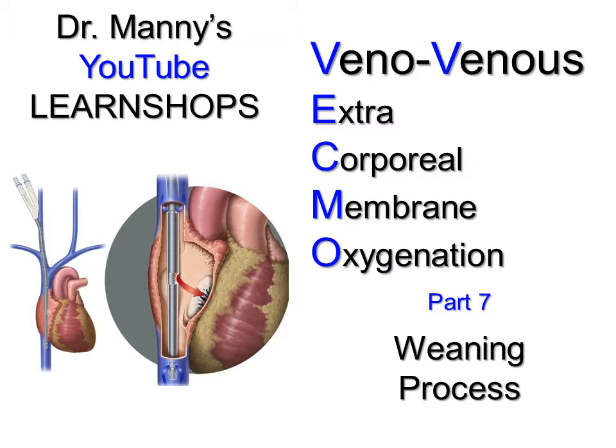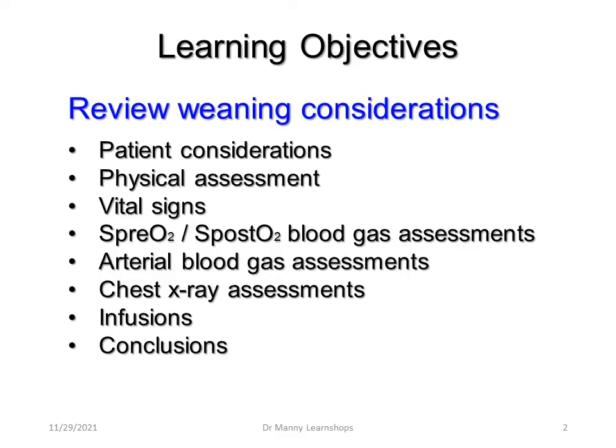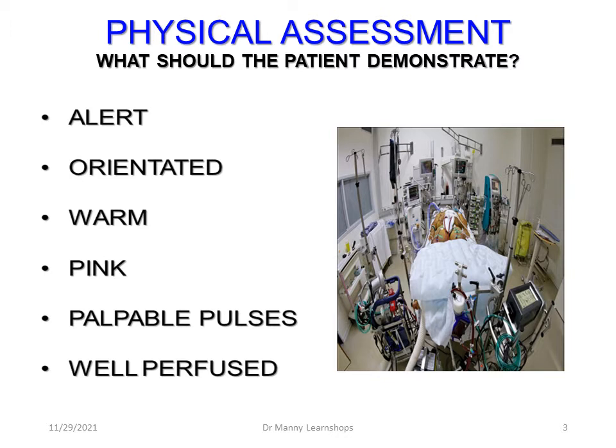This is part 7, the weaning process according to your organisational policy, but generically we look at veno-venous extracorporeal membrane oxygenation and how you might go about weaning the patient from it and the criteria that might be required. So when we review, we're looking at patient considerations, physical assessment, vital signs. We're looking at blood gas assessments which deal with pre-saturation oxygen levels and post-saturation oxygen levels, arterial blood gas assessment, chest x-ray assessments, what infusions should be weaned, and conclusions. So, when it comes to physical assessment, if we're considering weaning, what should the patient demonstrate?